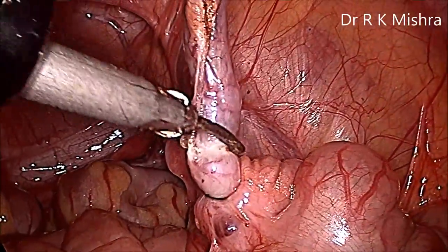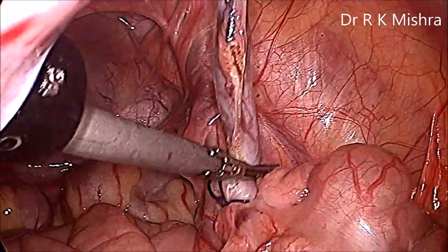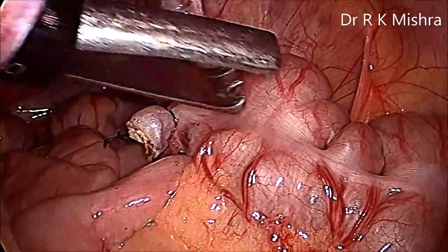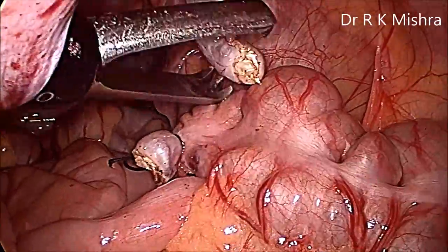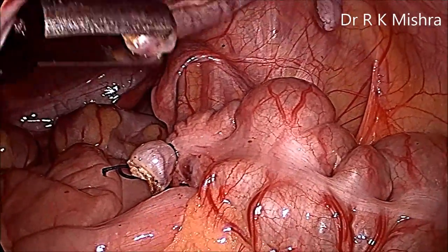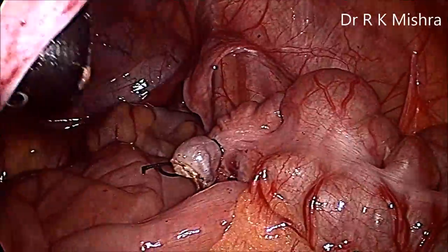After cutting, with the harmonic itself you can cut it partially — at one time do not hold it fully so that the mucosa also burns and it keeps sealing. Then rotate and catch the full appendix and transect it so that it burns the mucosa as well as seals it. Hold it longitudinally — first very gently, then drop the tip so that it becomes longitudinal, hold it tightly, and pull the entire appendix into the cannula. The Striker mini alligator drops the appendix and it is taken out.